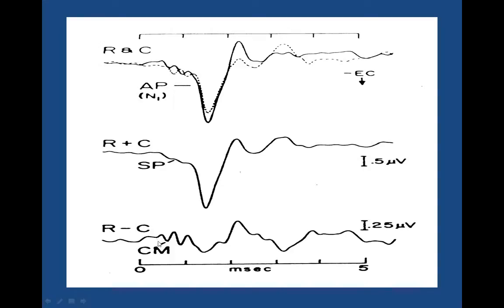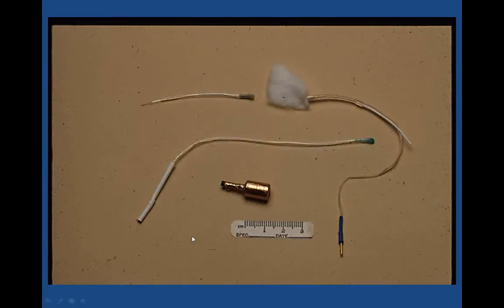If for whatever reason you want to study the cochlear microphonic, which has been the case, for example, recently regarding the diagnosis of auditory neuropathy or auditory neuropathy spectrum disorder or whatever we're calling that these days, then you could simply subtract the responses, and that enhances the cochlear microphonic. Today we'll primarily talk about the SP and the AP because the primary focus is how we're using those components to help make the diagnosis of Meniere's disease or endolymphatic hydrops more sensitive and specific.